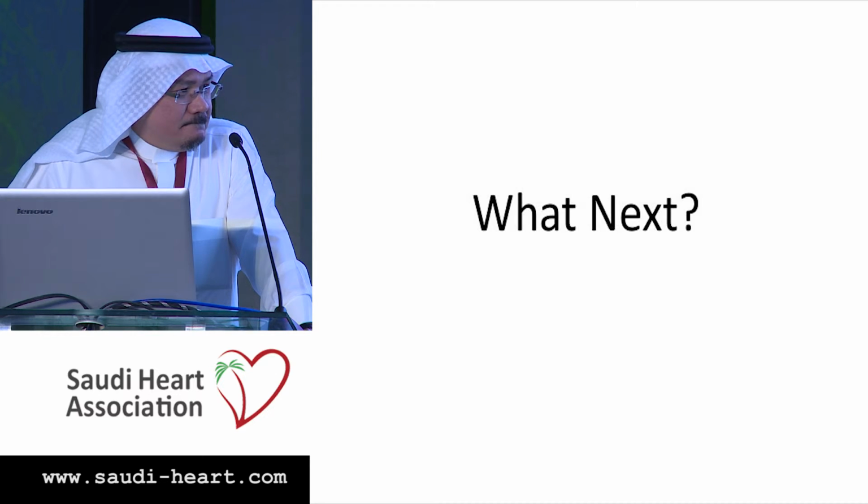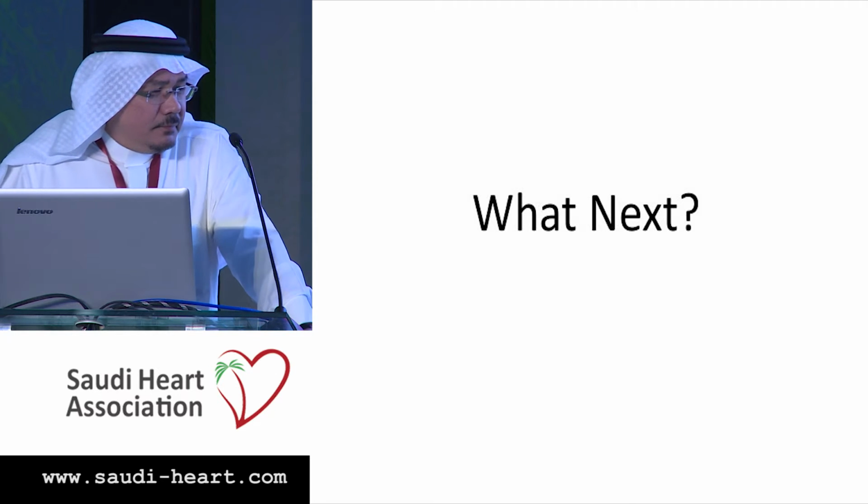Okay, Dr. Ahmed? So most likely I will try to open the artery because the patient is coming with a STEMI, at least to balloon it. If I see a lot of thrombus like this, I will stop and then I'll send the patient on 2B3A for 48 hours. I'll bring him back.